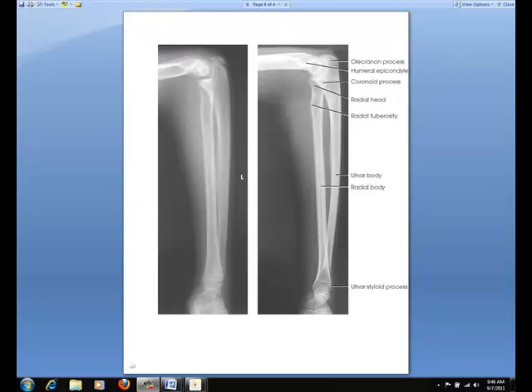When evaluating the lateral forearm, the following structures should be clearly shown: the wrist and distal humerus, superimposition of the radius and the ulna on their distal end, superimposed lateral humeral epicondyles, and the elbow should be flexed at 90 degrees.